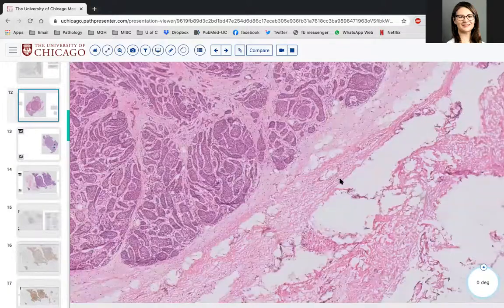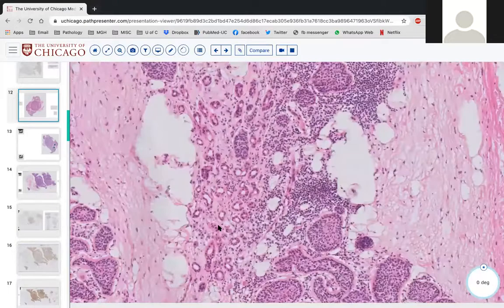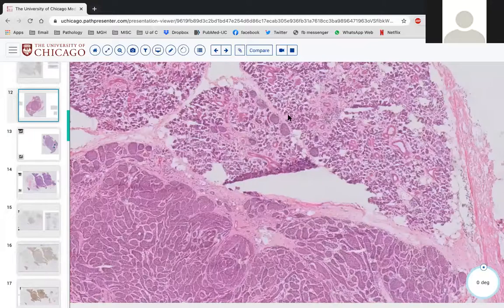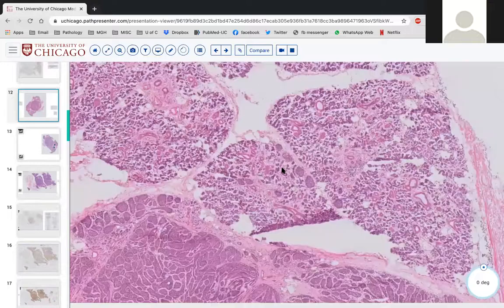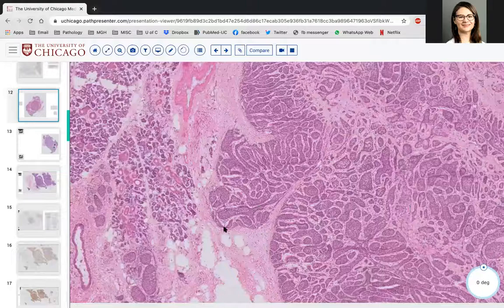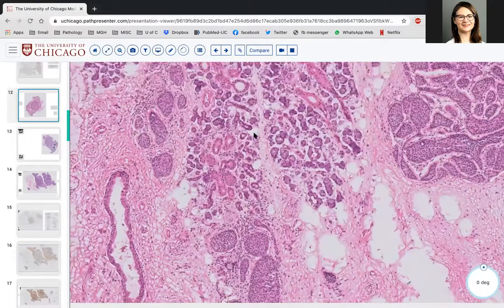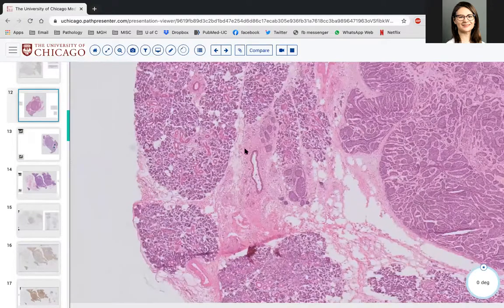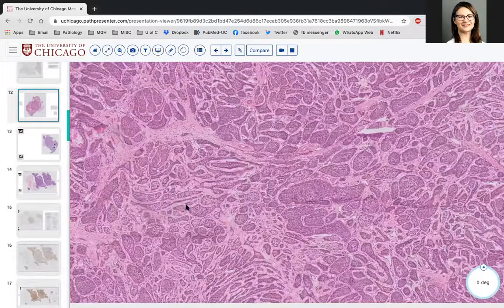Yes. So I believe with basal cell adenoma we shouldn't see any invasion. So here basal cell adenocarcinoma should be in that differential diagnosis. Exactly. The only way to distinguish a low-grade basal cell adenocarcinoma from a basal cell adenoma is infiltration. And I think you can all see these skip islands of tumor separated by normal gland. So basal cell adenocarcinoma, I think, is a perfect diagnosis for this and is a lovely, lovely frozen section.